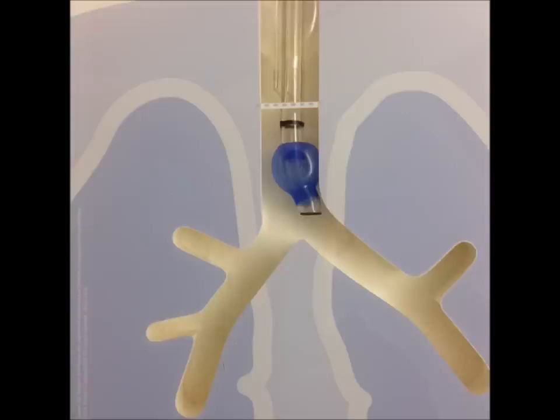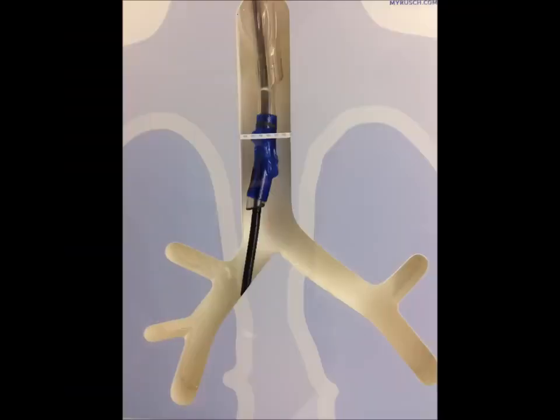Keep the bronchoscope in the room because you will confirm the placement, and once it's confirmed, then you're good to go. Here's another example of a tube which has come out. It's a left-sided tube, come out too far, and you really just need to let both cuffs down and advance the tube.